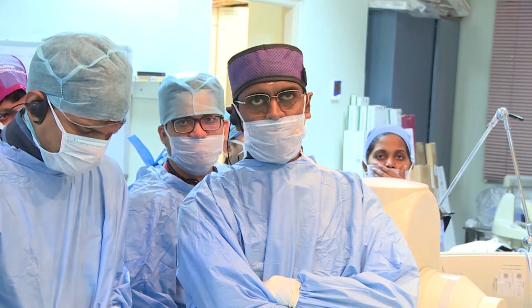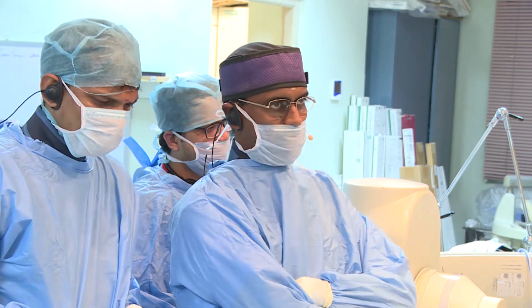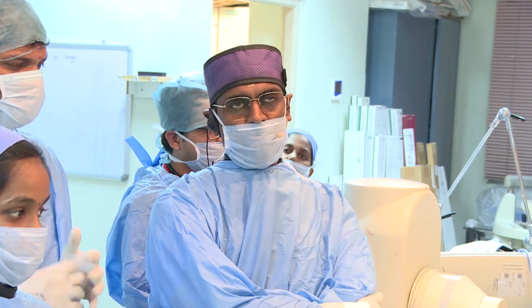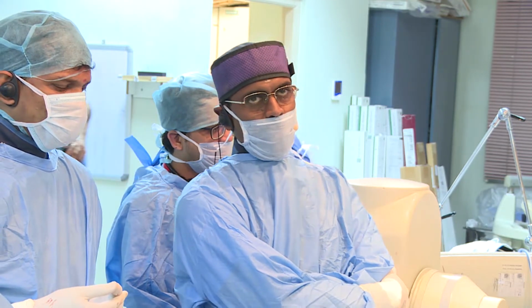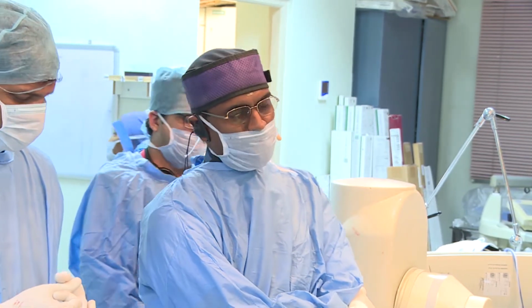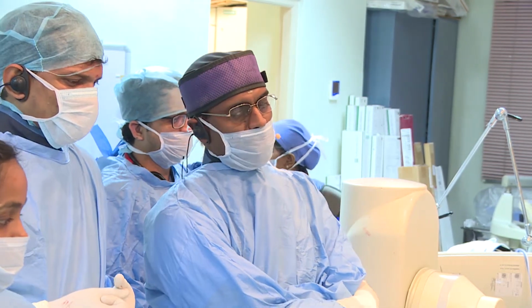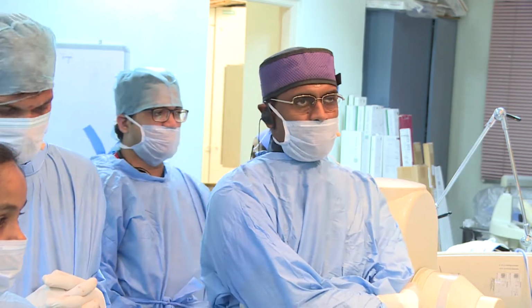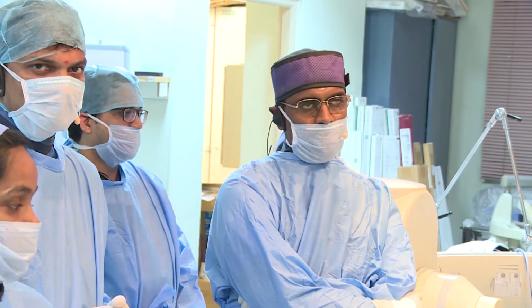So it seems like we need to get a better understanding of the pulmonary hemodynamics. I apologize if I missed it, was there a saturation step up from the SVC to the pulmonary arteries? There was a 13% step up from the SVC to pulmonary artery in the previous catheterization that was done about 1 month ago. We did not do one today because we cannot accurately assess the final mixed pulmonary artery saturation. The ductus may be streaming to the right, may be streaming to the left, but in the previous catheterization, the superior vena cava to distal pulmonary artery step up was 13% with no step down.